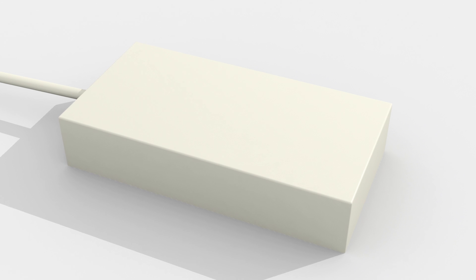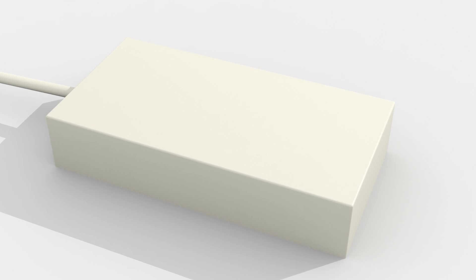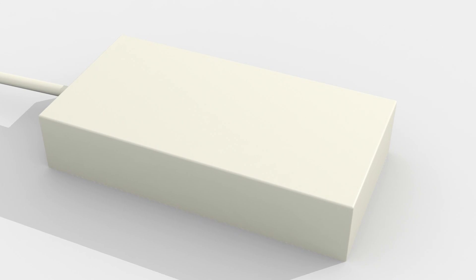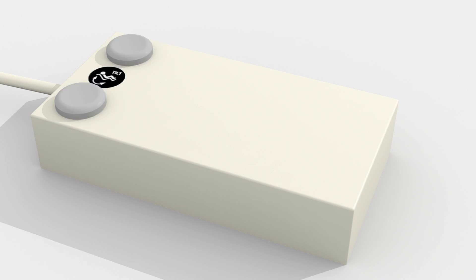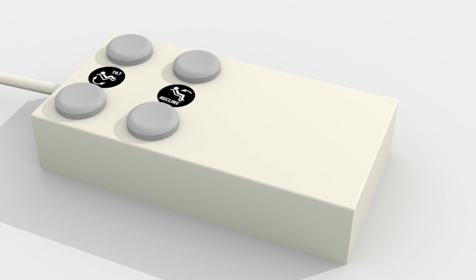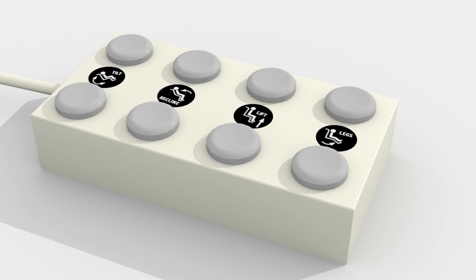Most switch boxes are designed to provide direct access to four different seating functions: Power Tilt, Power Recline, Power Lift, and Power Leg Rest Elevation.